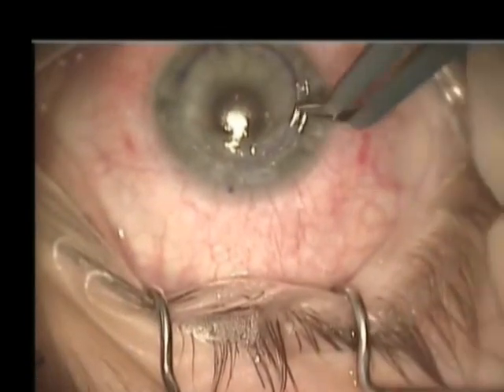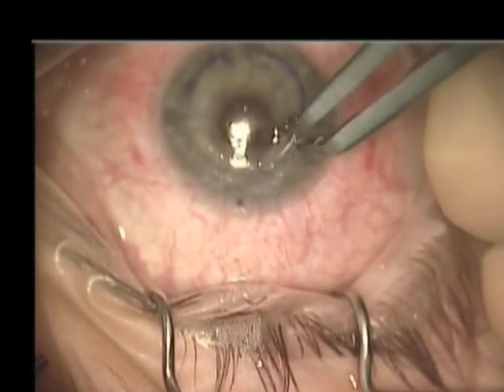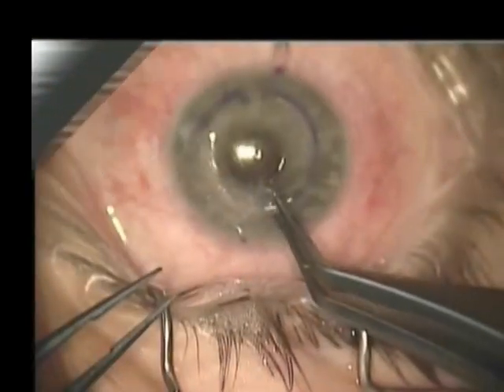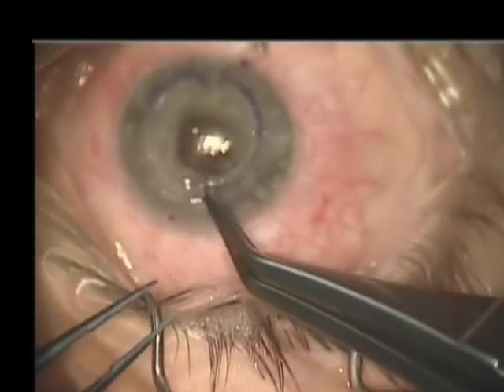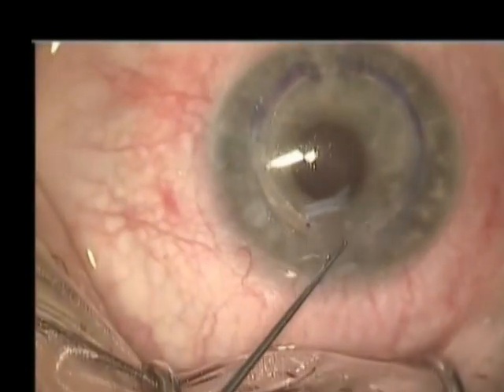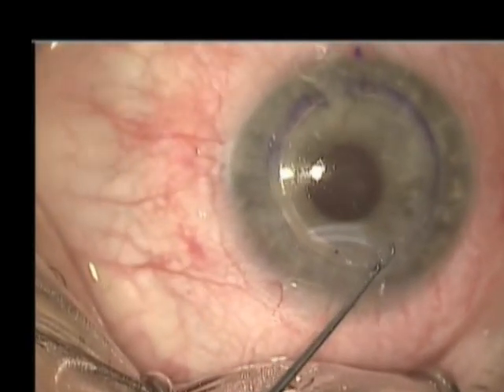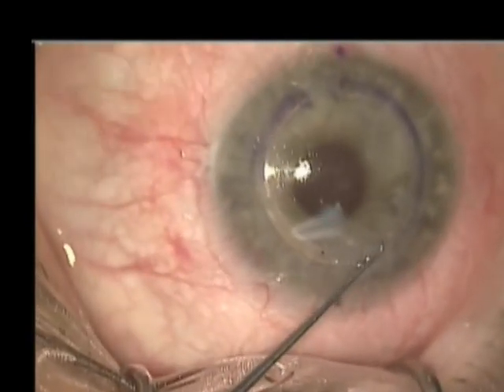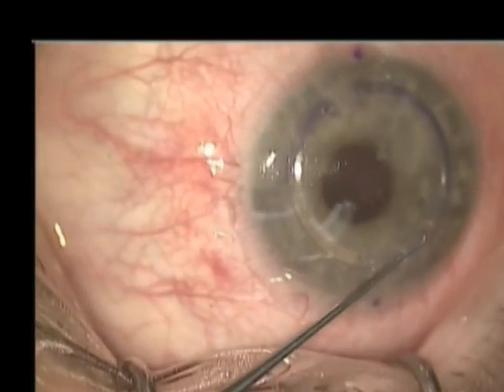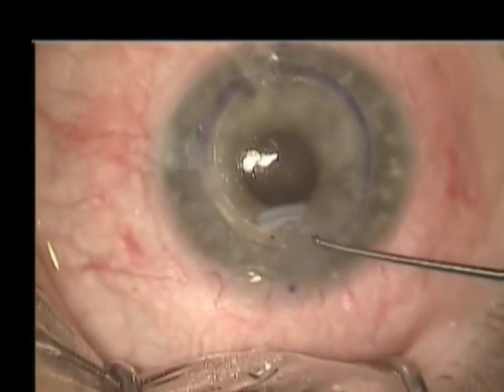The same process is again accomplished with the superior INTACS segment. A Sinski hook is used to push the proximal border of the INTACS segments approximately one to two millimeters beyond the incision.